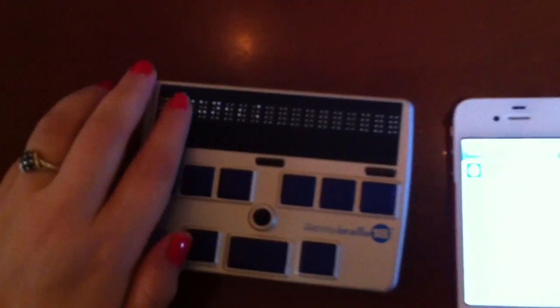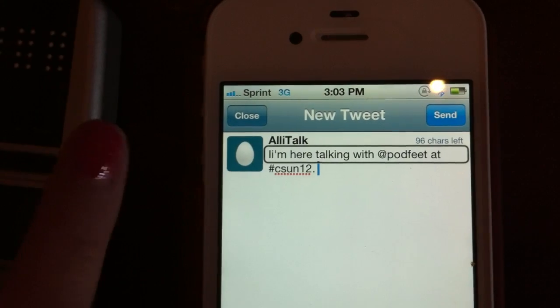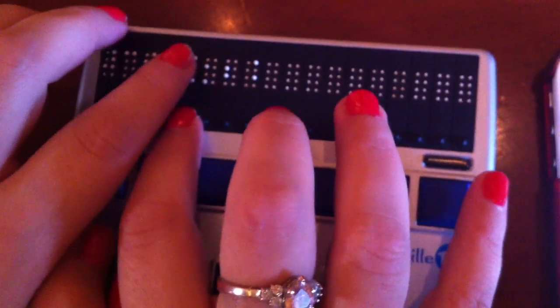I want to show them how it pulses. There it is. So those look like lights, but what those are actually are little tiny dots sticking up, but they sort of pulse. It's cool. It's like a cursor blinking. It's essentially the same thing. Yeah, because this little dot underneath here is the cursor, and if I want to change where I'm typing, if I want to add or delete a letter, I will press the button underneath the letter I want to edit. Oh. And that's how I can delete and add letters in. So it's like editing with a print cursor, except it's all tactile.